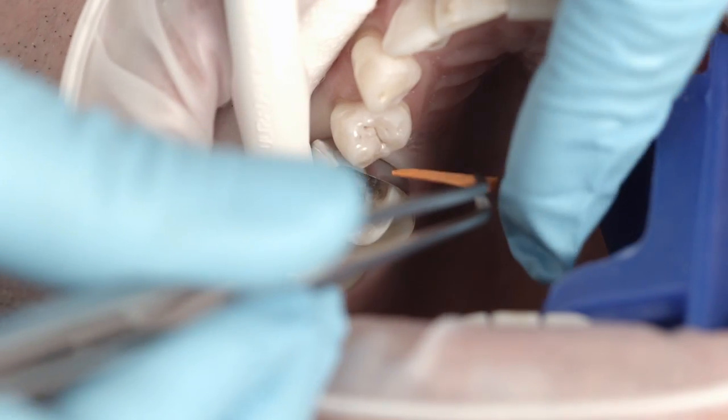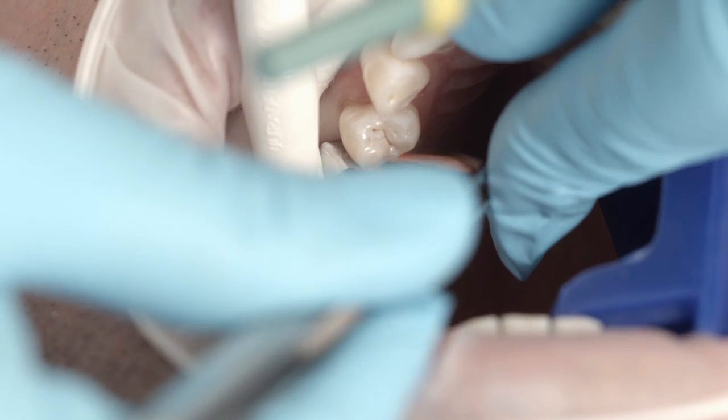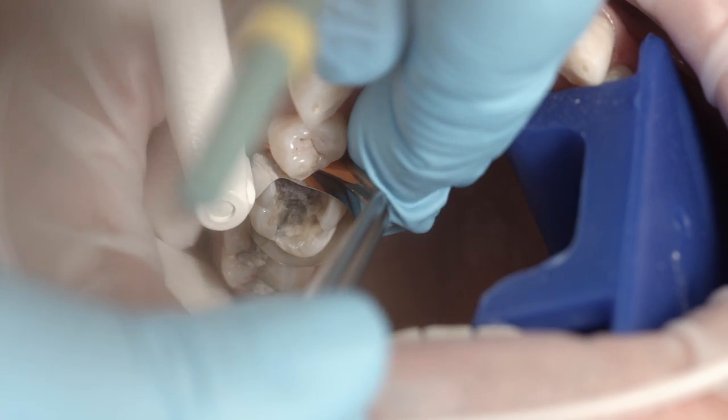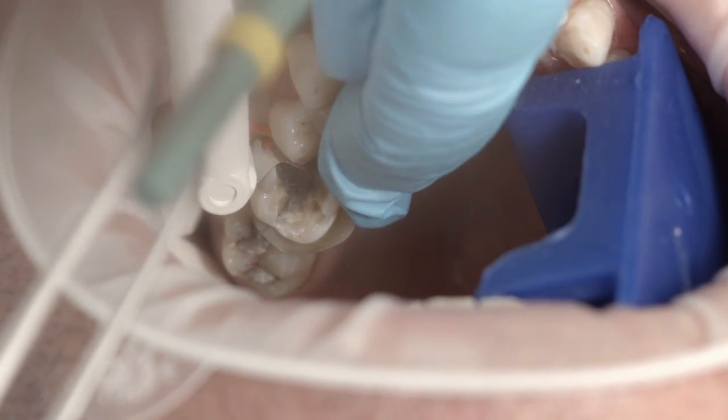Carefully secure the matrix in place using wedges. Establish a dry working field. If necessary, use a saliva ejector or cotton rolls to do so.